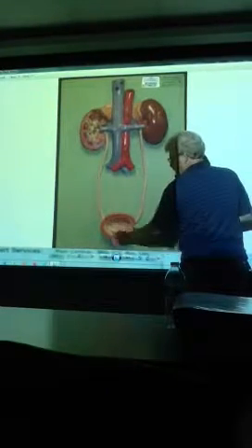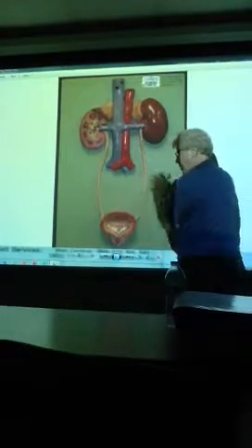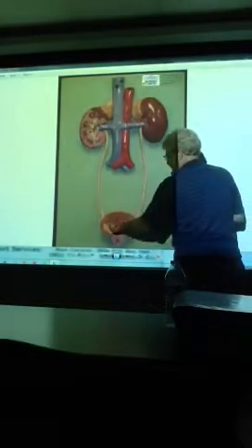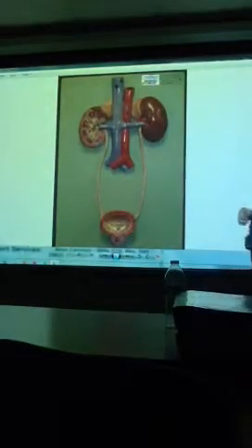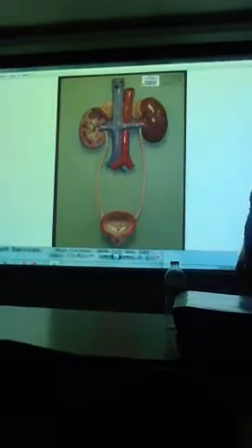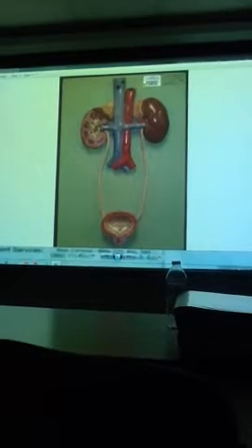Alright, there's your fundus. You can see this is your transitional epithelium all bunched up before it's been stretched out. That's why it looks like a honeycomb here. And your detrusor muscle is the muscularis here. Wow, we done pretty good.